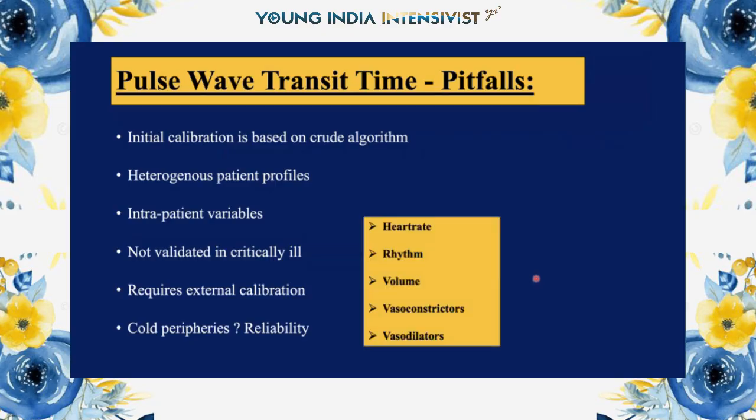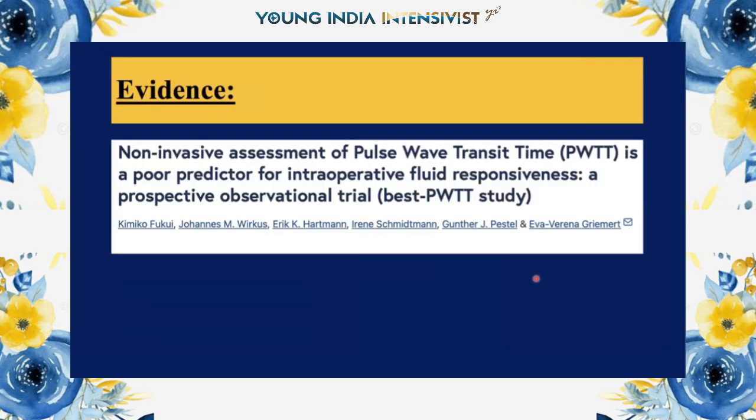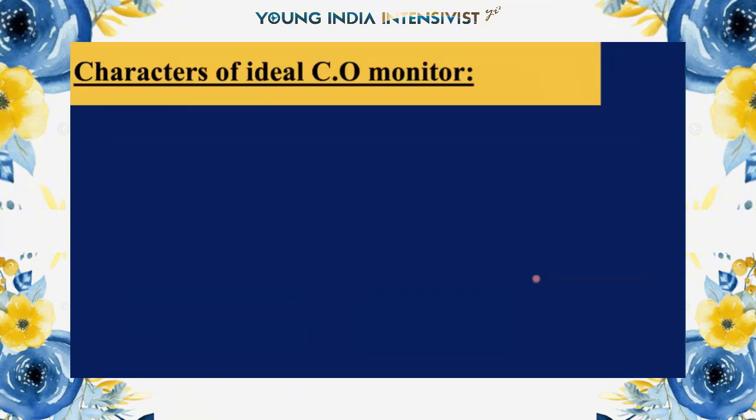Okay, and it is not reliable in case of arrhythmias, hypovolemic states, use of vasoconstrictors or vasoactive agents or vasodilators. So in critically ill patients, the performance of the pulse wave transit time monitor is not clinically acceptable and it is not recommended at the current standpoint. The same goes with this study as well. It is not recommended to assess intraoperative fluid responsiveness.